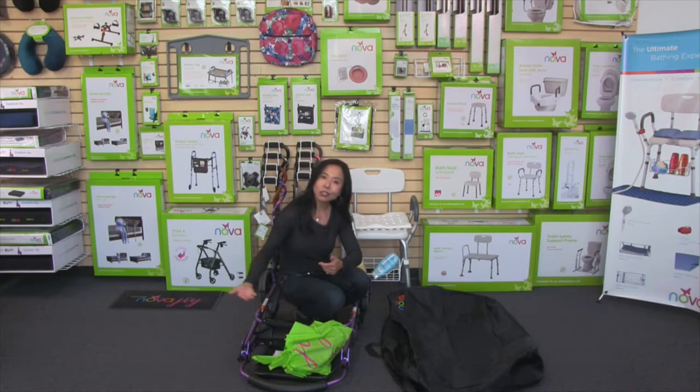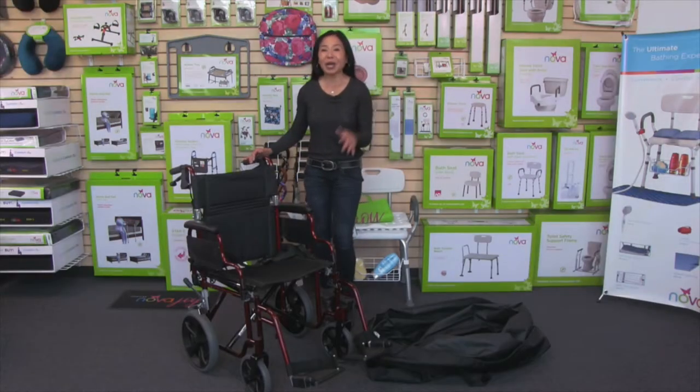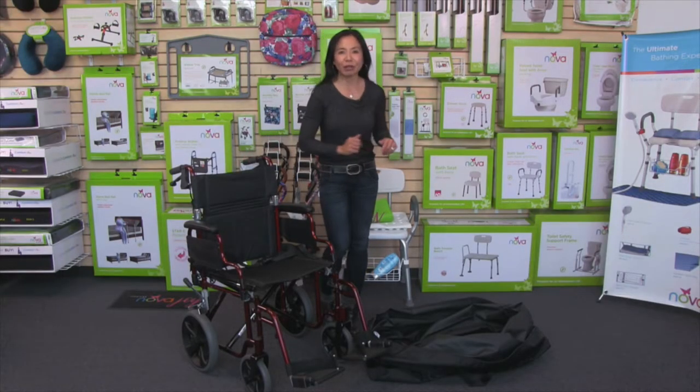Then you're all set and you just have to slide the walker into the travel bag. Now I'm going to show you how to fit your transport chair into the travel bag.